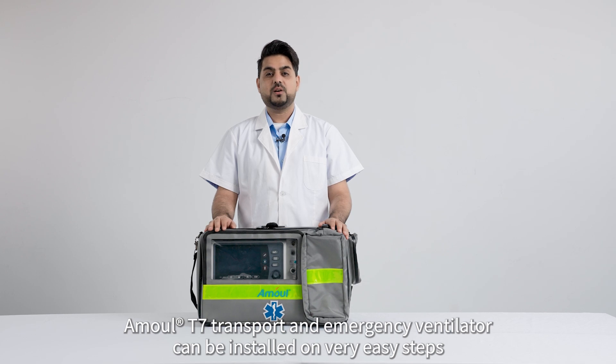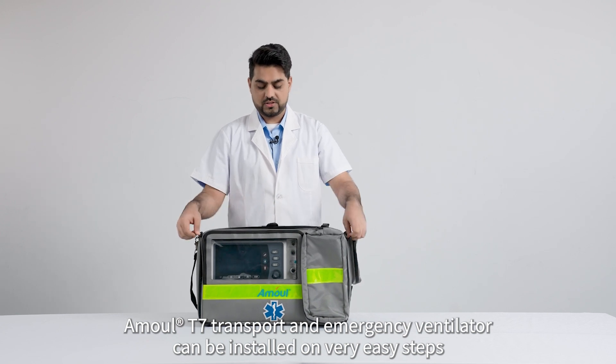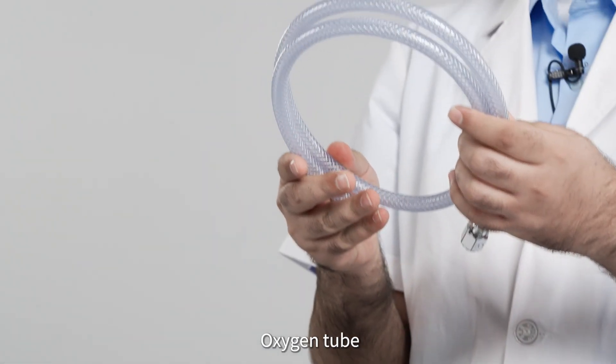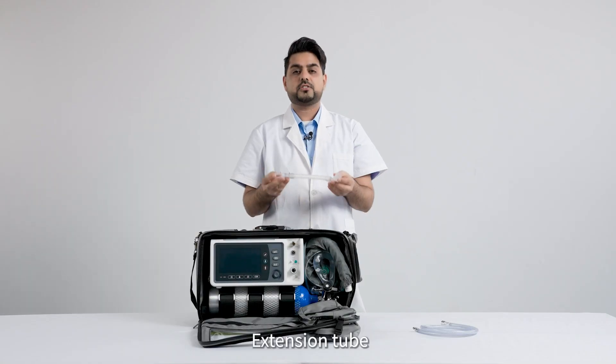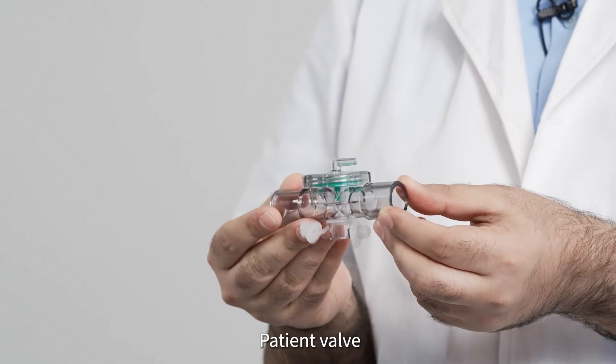The T7 transport and emergency ventilator can be installed in very easy steps. Components include the oxygen tube, extension tube, and patient valve.